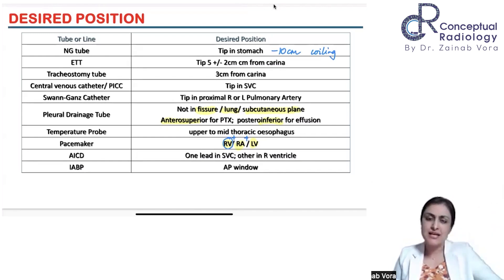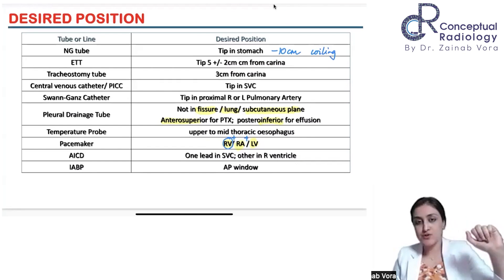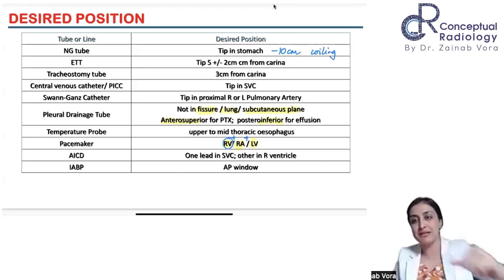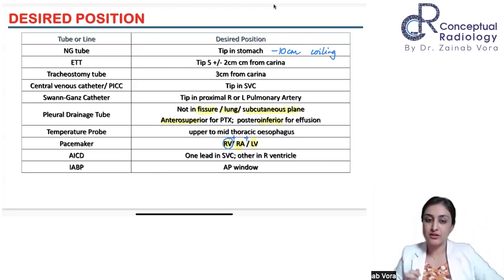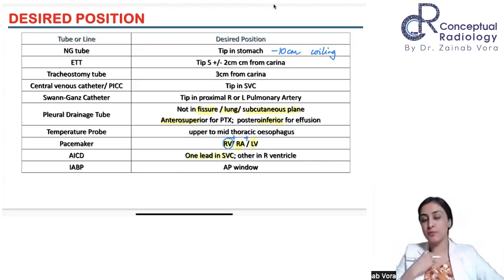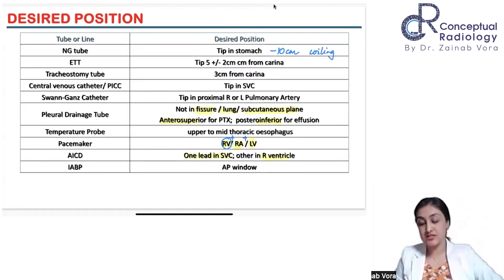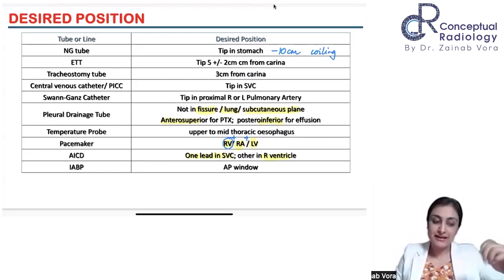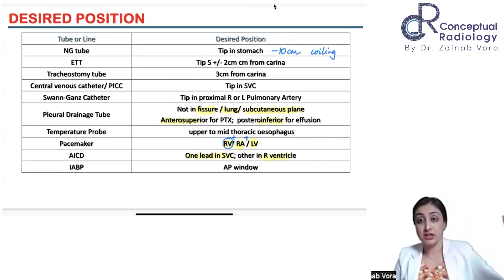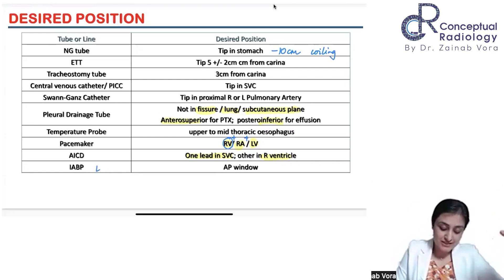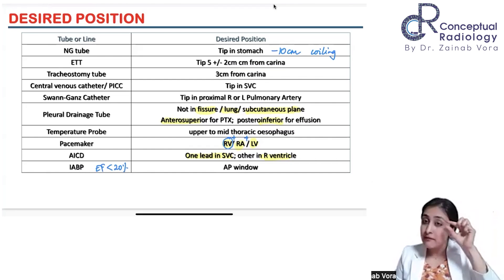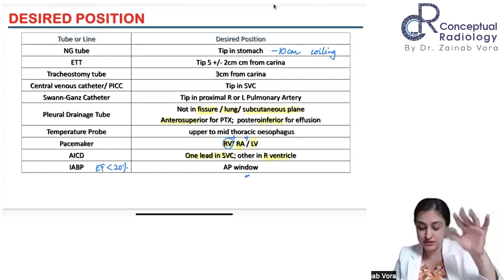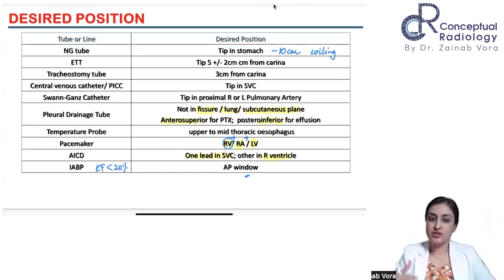In some patients the pacemaker lead is placed in the coronary sinus instead of the right atrium. An AICD (implantable cardiac defibrillator) looks similar to a pacemaker with a subcutaneous generator, but the lead is different — one lead is more proximal in the SVC or brachiocephalic and one is in the RV, with a slightly different-looking distal lead. An intra-aortic balloon pump (IABP) is used in cardiogenic shock when ejection fraction is less than 20%; we see the metallic part of the balloon in the aortopulmonary window.